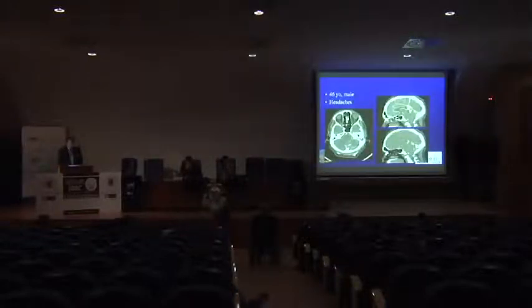And you can keep going through situations that look more complex, like for example this guy, the example I was telling you, that had multiple failed attempts for endovascular treatment in many different hospitals. This is a patient that got multiple embolizations, and you're going to see here an angiogram done on the outside, and you see all these nice feeders that probably many of us would say would be able to get that fistula.